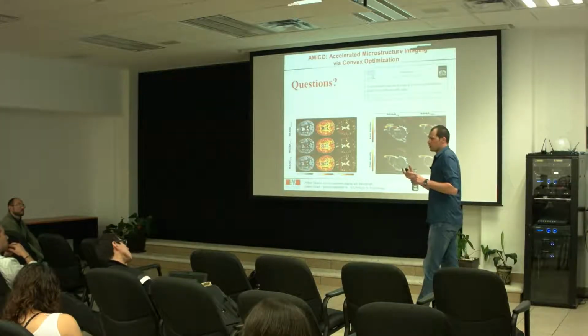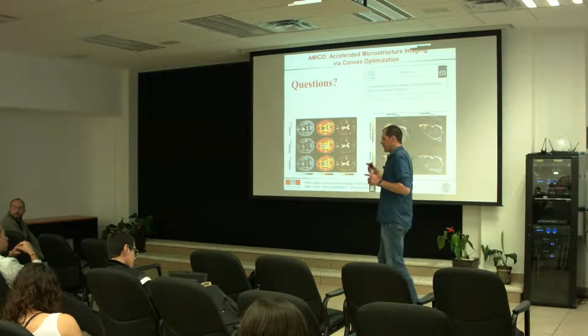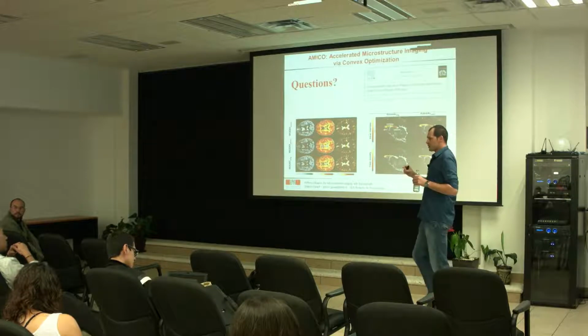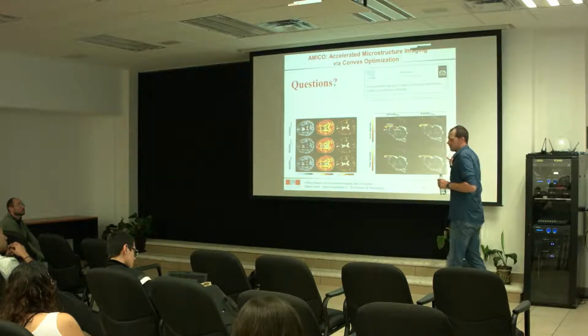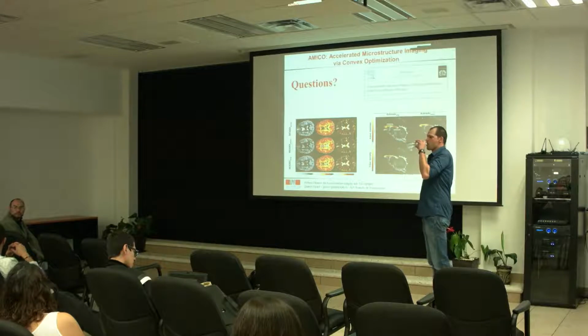If you have something a bit more complex, you might need simulation for those type of compartment. But this is something that you can add and use the framework to then do the fitting. Essentially, AMICO is just a fitting framework given a set of kernels. So you define the kernels the way you want, and then you use the mechanic of the framework to get the fitting, and then you extract whatever you want out of this fitting. Thanks.